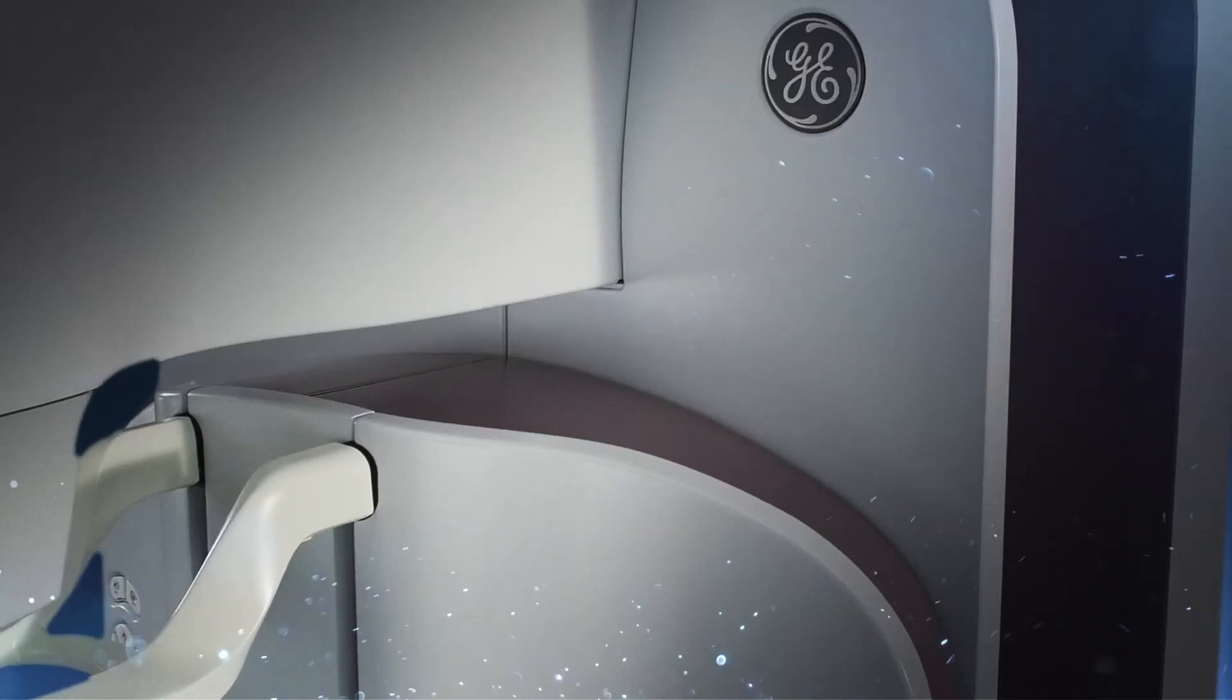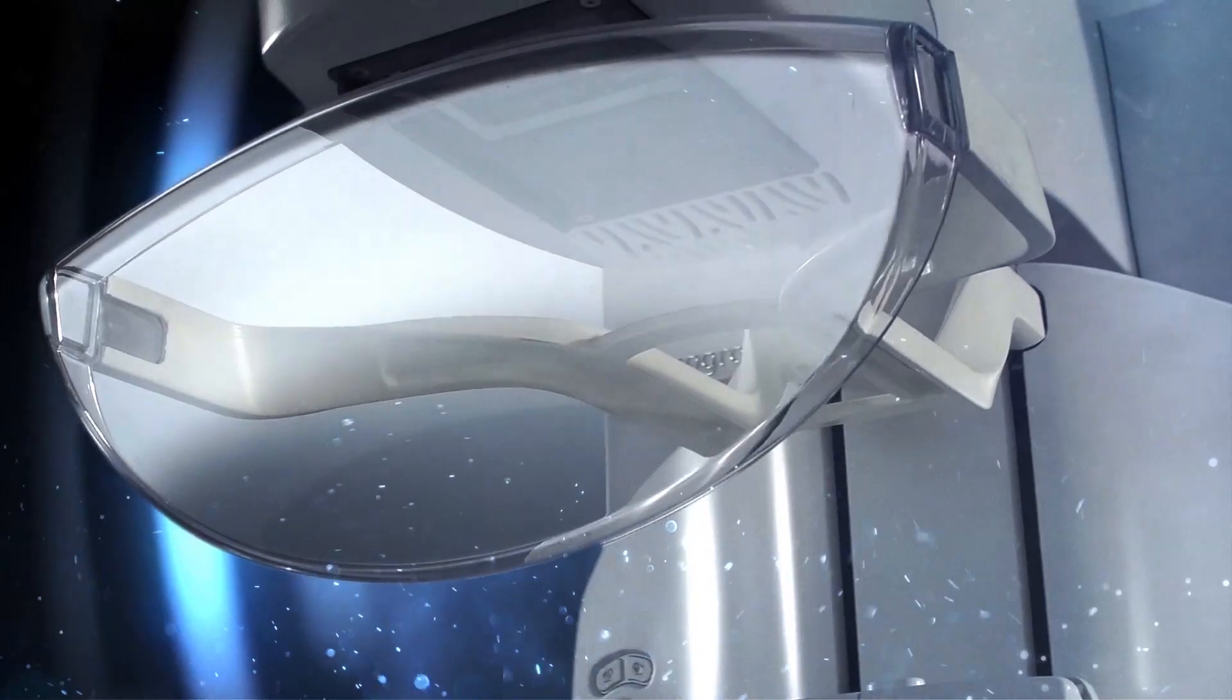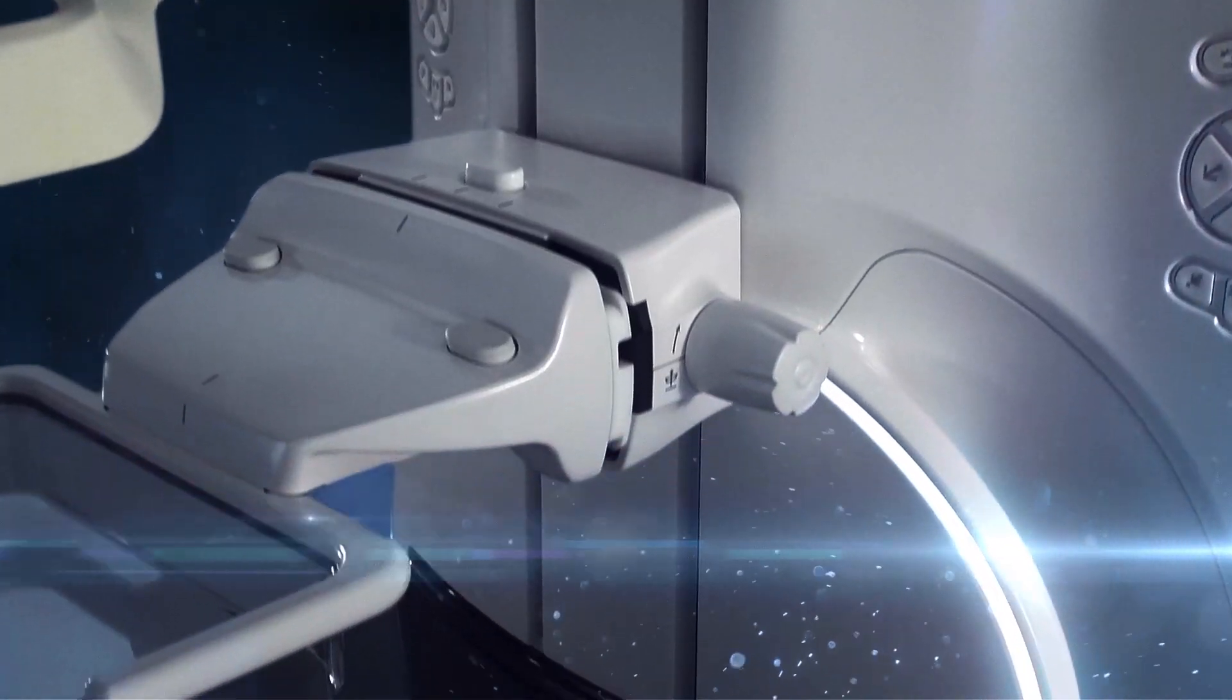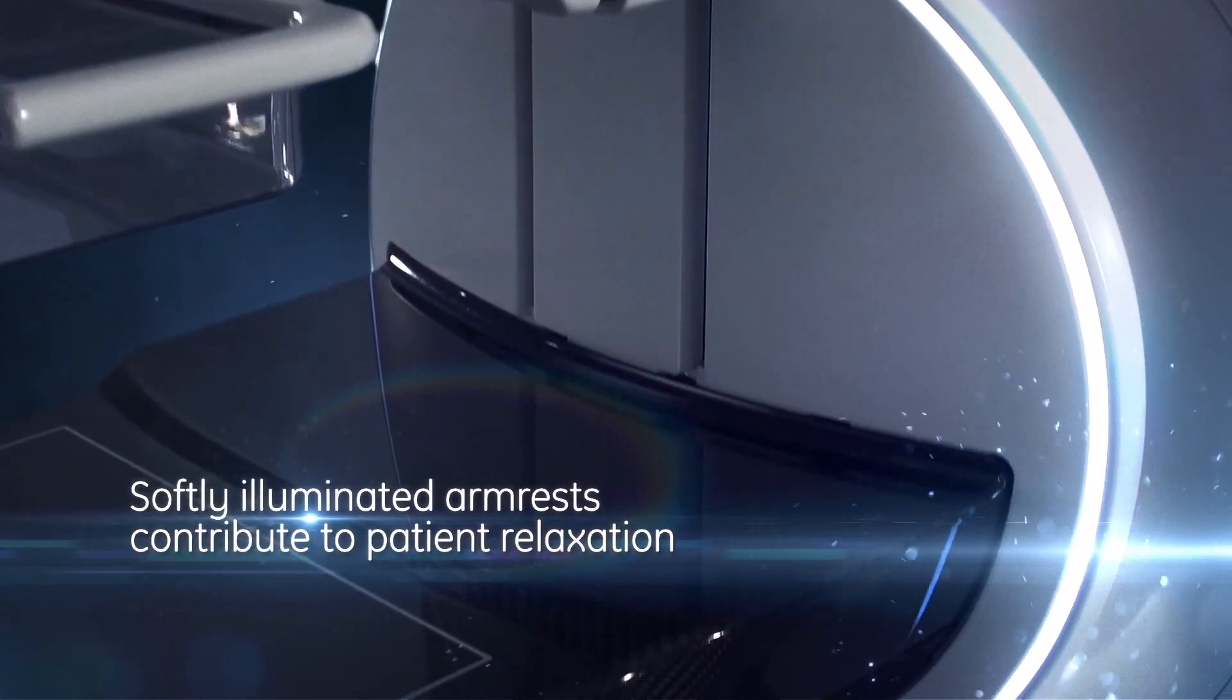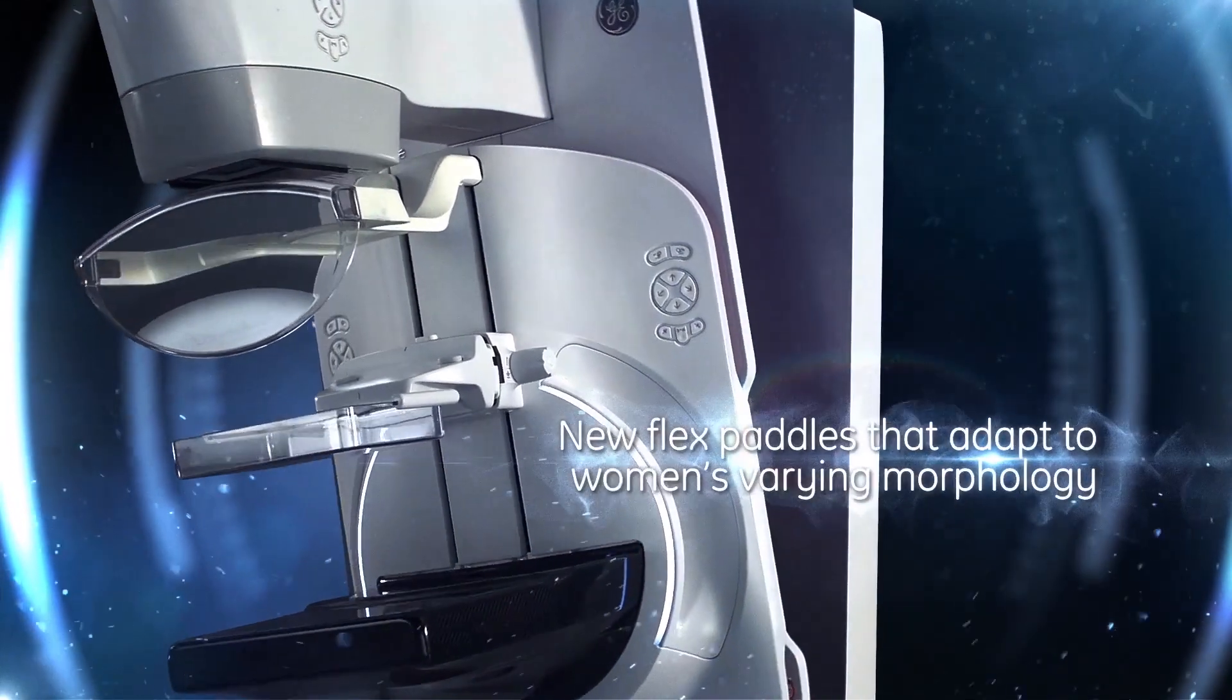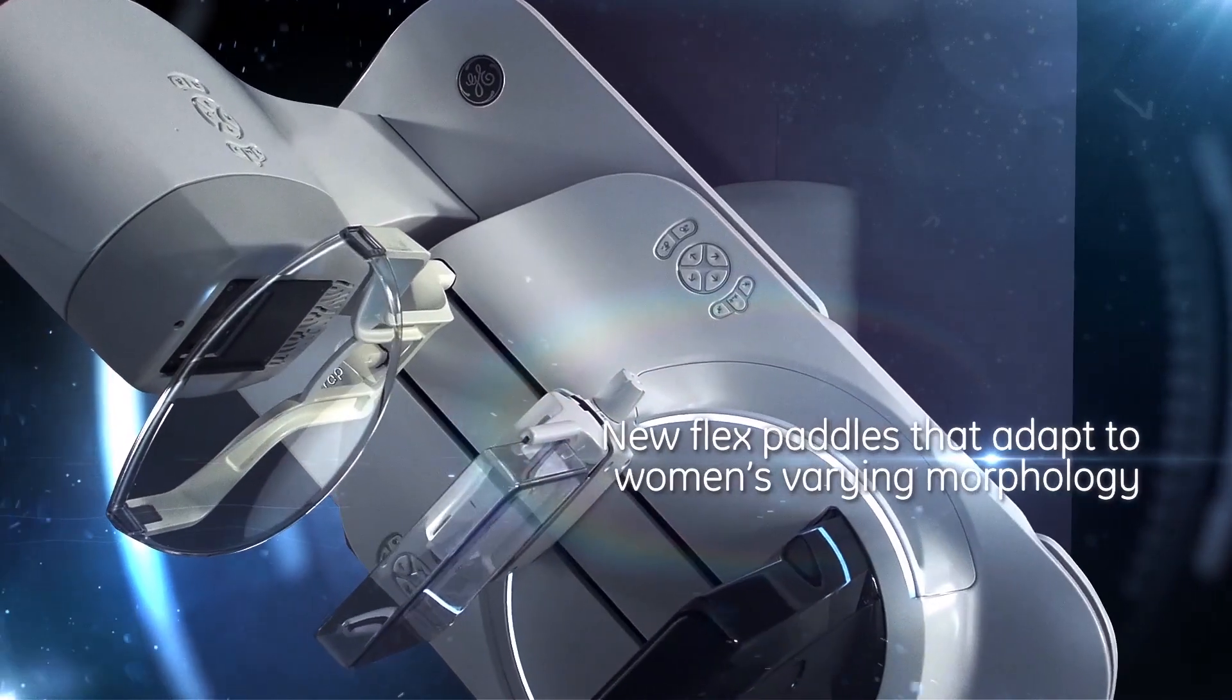Senagraph Pristina is engineered to ease a woman's anxiety from the moment she enters the exam room. Clean lines, sensitive design, and newly imagined ergonomics enable a space of comfort and support.